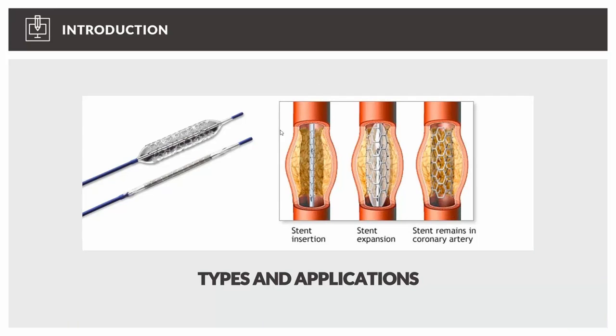It's the way they are applied and inserted into the body, because if you think about it, there are basically two options if I want to bring something inside the vessel. One option is to open the vessel externally, which means you really need to destroy a lot of healthy tissue around the vessel, and therefore it's not the way we want to go. Another technique, which is used for more than 50 years, is the so-called balloon implantation.